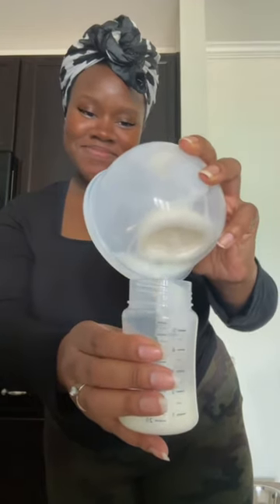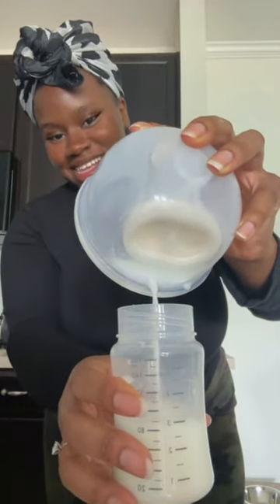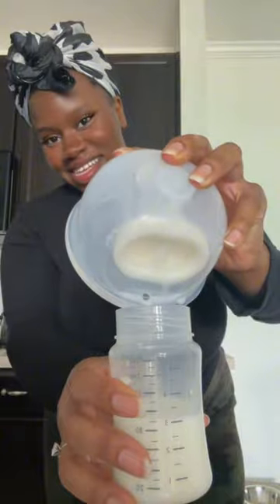This is the right side. Get every last bit. We got two ounces on the right side, so let's see the left. It is like three and a half ounces.